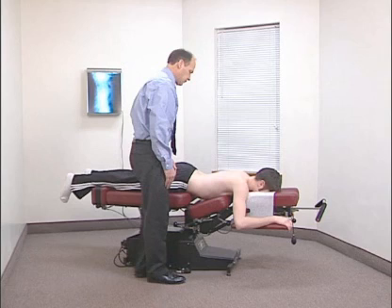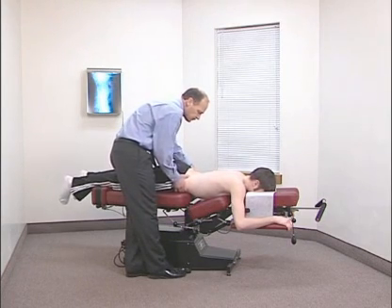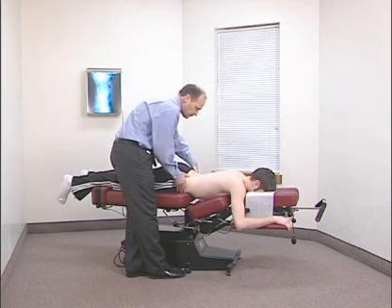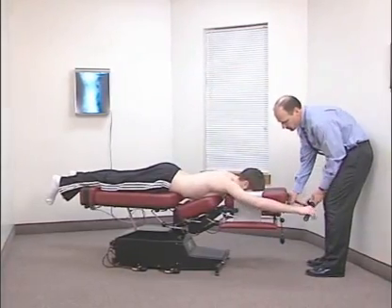Patients with large breasts, intercostal neuritis, clavicle disorders, post-abdominal and chest surgeries, and barrel-chested individuals may have discomfort with the top edge of the abdominal drop. For better comfort, reposition the patient by moving the patient's iliac crest down 1 to 2 inches below the top edge of the caudal section. Never have these patients move up. Always have these patients move down on the table.